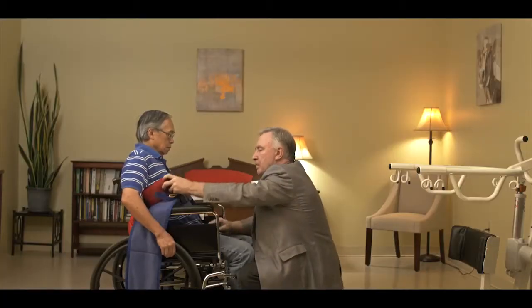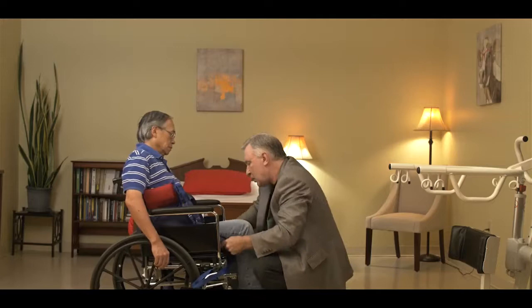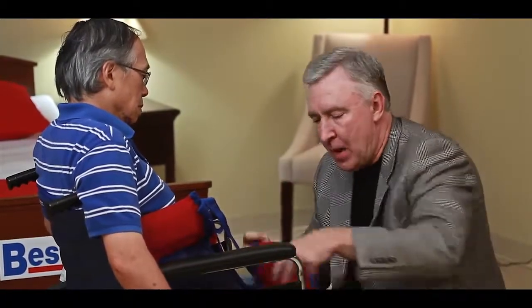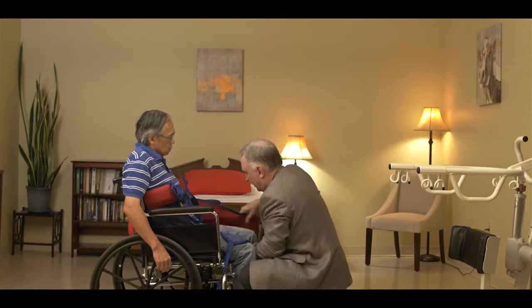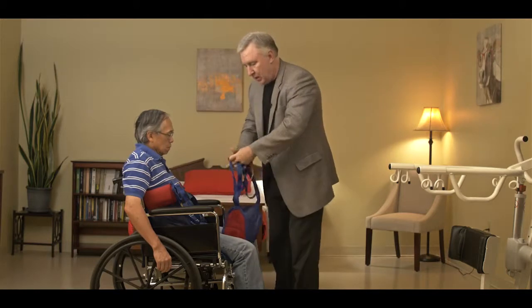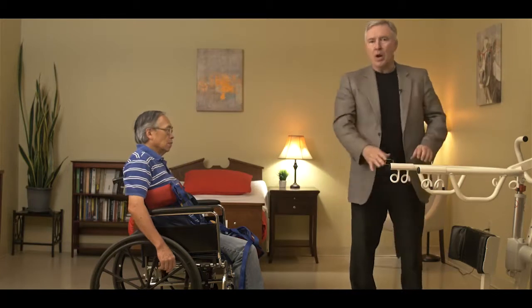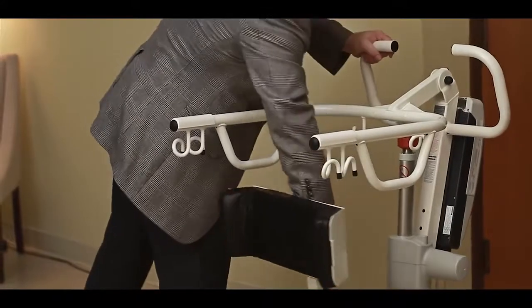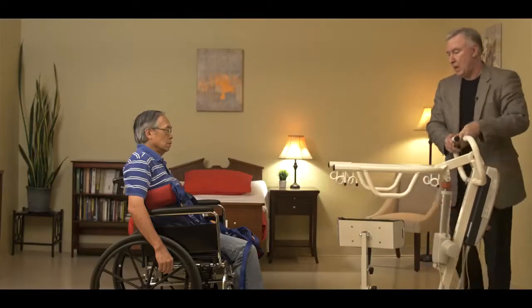Take the leg straps, bring them around the hip and underneath the leg into about the center area between the knee and the hip. Do the same with the other side. Last, crisscross the leg straps. Now let's prepare the SA product to attach to the sling — simply take the knee brace and foot plate and remove it from the lift. Approach the patient, open the base, bring it up to the person, and lock the casters.